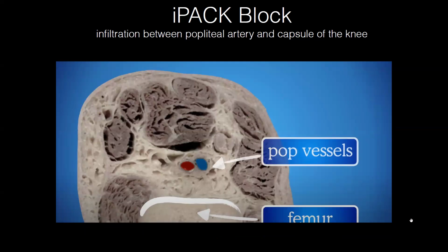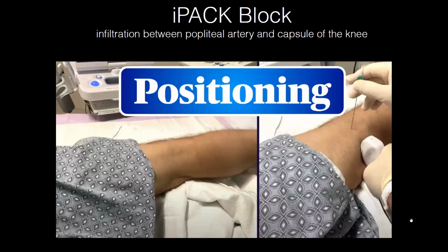Those are your hamstring muscles. And you have the vein and artery and the nerves. This is the bone. In the bone, you could be at the condyles or you could be at the metaphysis, and that's going to become important. So I prefer this lateral. Some people do it frog leg. Curvilinear, because you get a view of the whole thing rather than chasing your needle, but you could use either.